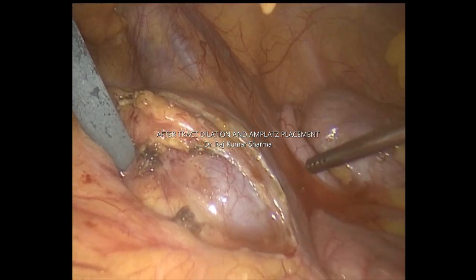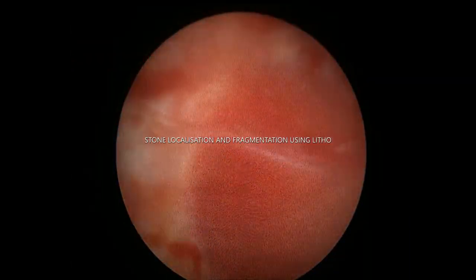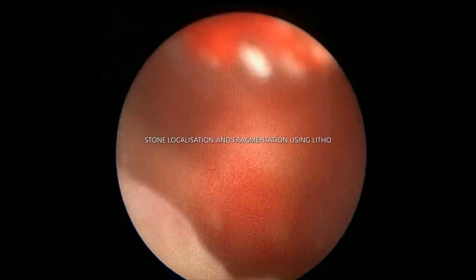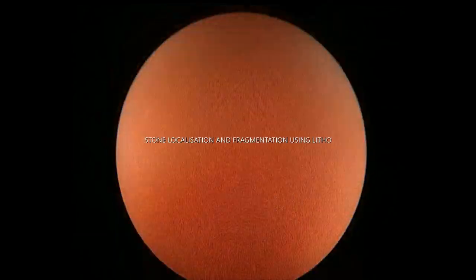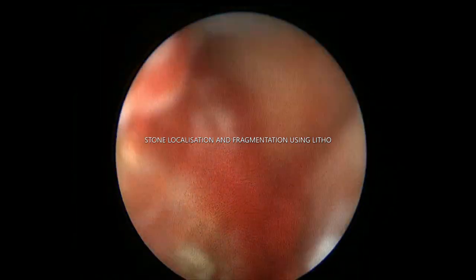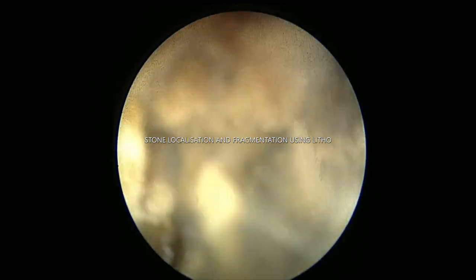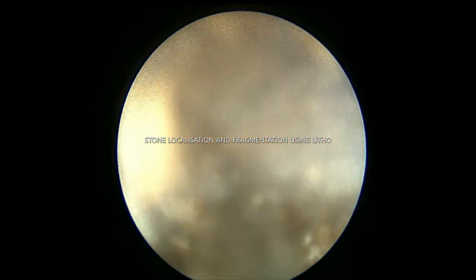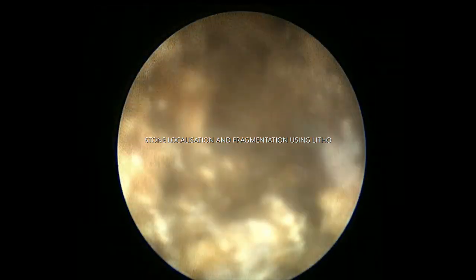The next step is to find the stone, fragment it, and then remove it. Lithotripsy is being used here because it is very fast for large stones. This is how the stone is being treated and removed.